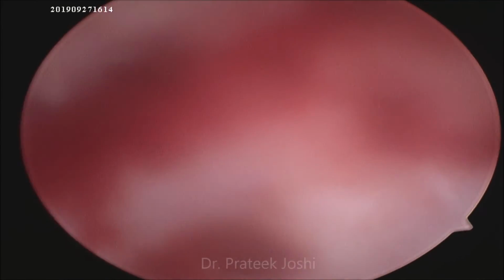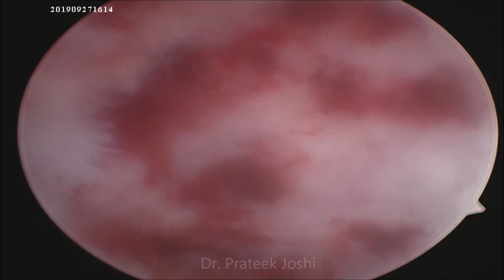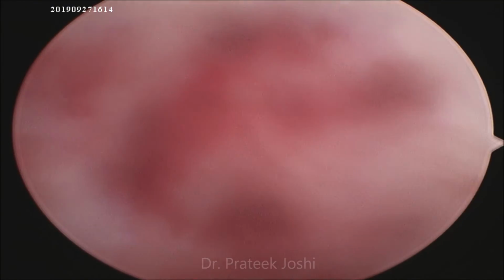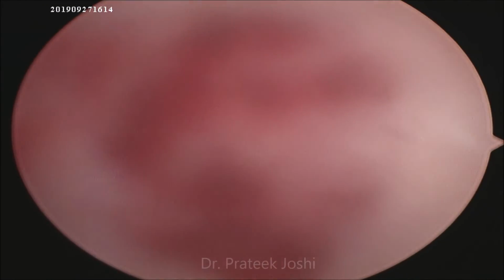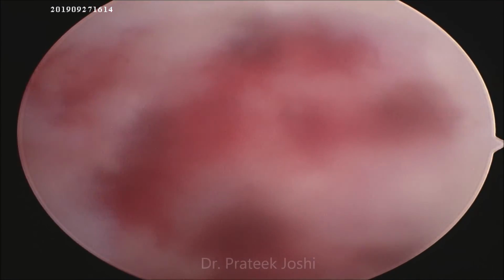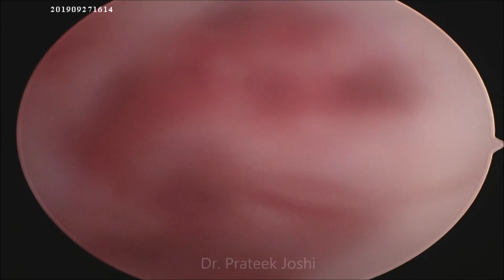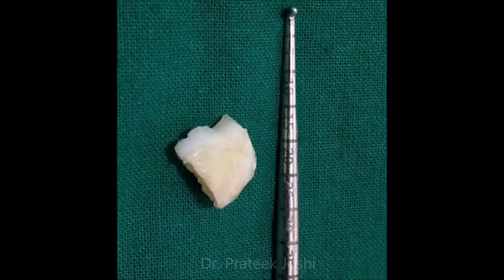So now we have deflated the tourniquet to visualize the oozing of the bone marrow material through the microfracture holes. This is the unstable OCD fragment which was excised from the joint.